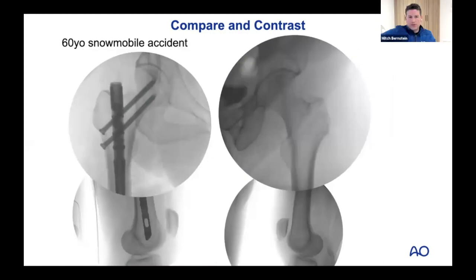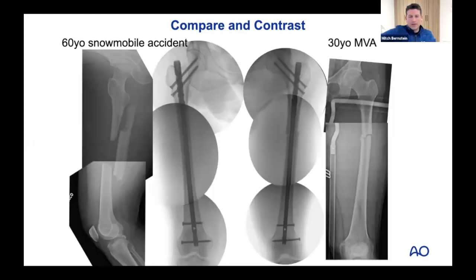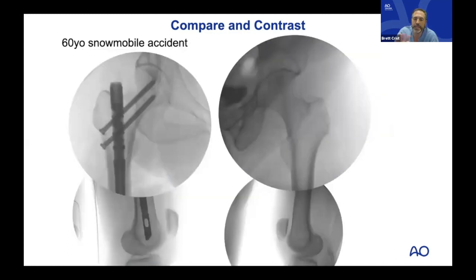Can you go back real quick? I have a question too for him, Brett. Okay, go ahead, Brett. I was just going to say, it goes to the point about getting the x-rays right. The rotation is not the same on the right versus the left. The left one, the patella is centered. The right one, it's not. That's why I like the AP view, I use it, but that's not what I hang my hat on, because it's so hard to get it exactly right. For me personally, I'm not saying that it wasn't off, but just think about that.